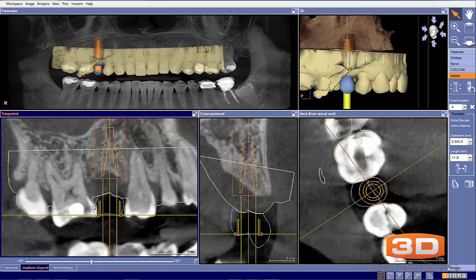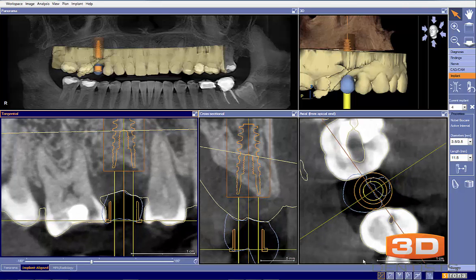We can see that this tooth has tipped forward. Now, certainly if the patient were interested in properly correcting the space or maybe doing some restorative work on tooth number 3 to enhance that amount of space that we have, that would be a different story.